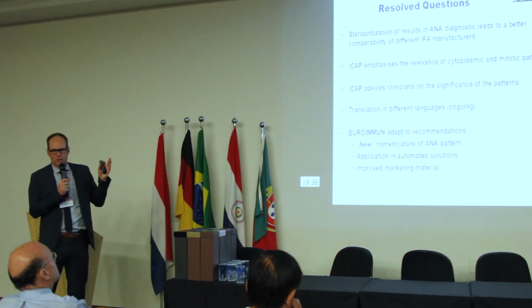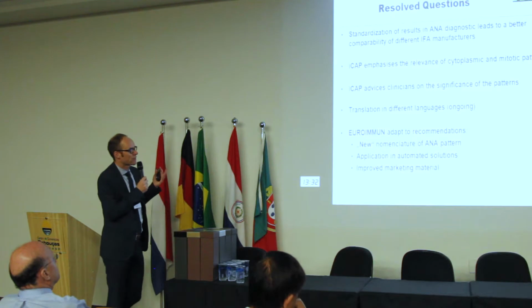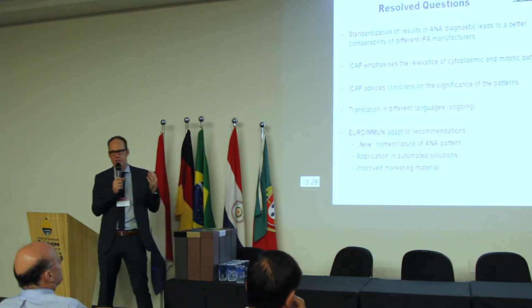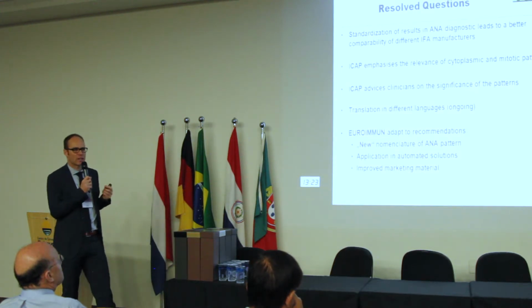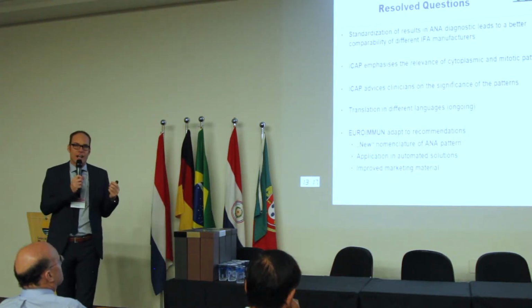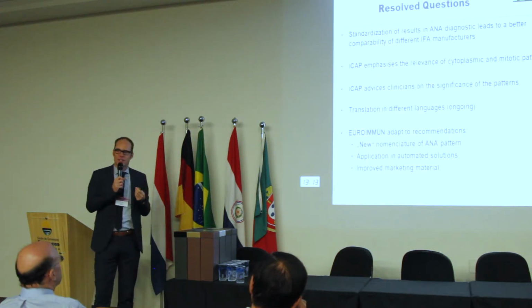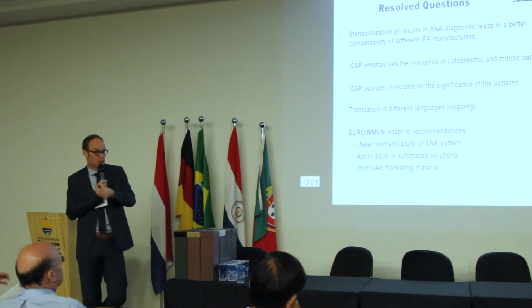And what is now still ongoing is that ICAP also advises the clinicians of the significance of the pattern. So what does it mean if it's homogeneous positive? Homogeneous maybe is a better example because everyone knows that it's related to SLE, but there are other patterns where maybe it's not that clear. And here also ICAP gives good advice, and it's an international advice. So it's not that the Brazilians talk different from the Germans and the Japanese, for example.